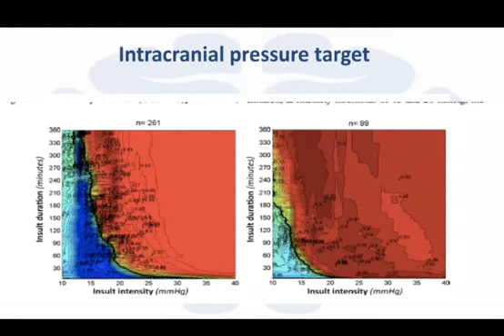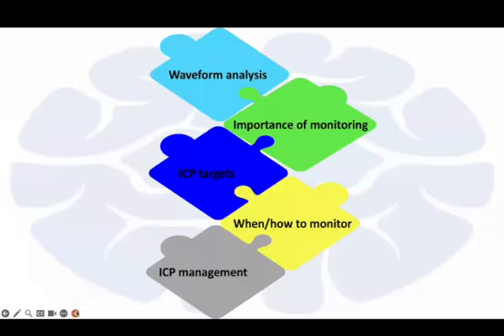This means in the clinical practice that if I have a patient with ICP and he has been suctioned by the nurse, and ICP goes to 28 for a few minutes because he's coughing, and then goes back to normal, I'm not very worried. I'm very worried if I have a patient who remains at 22, 23, 20 for many hours, because it means that the duration of the insult is very long.